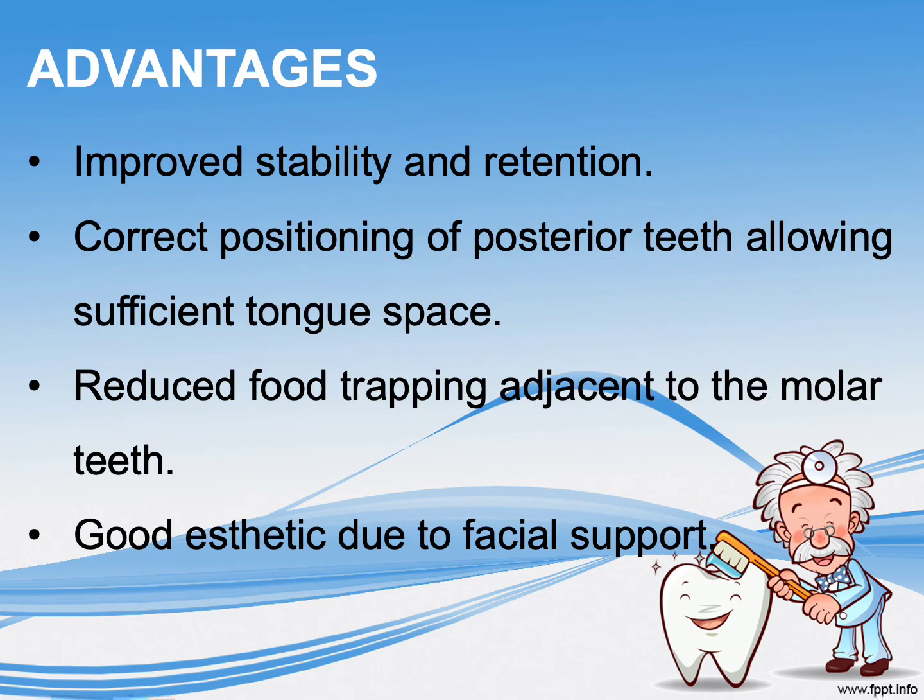Advantage: improve stability and retention, correct positioning of posterior teeth allowing sufficient tongue space, reduce food trapping adjacent to the molar teeth, good aesthetic due to facial support.